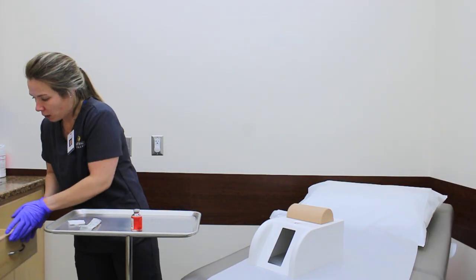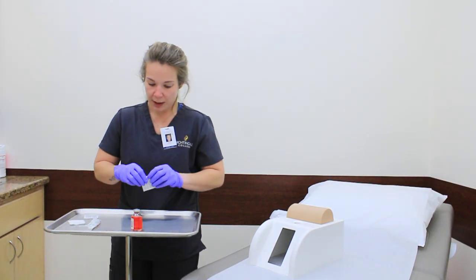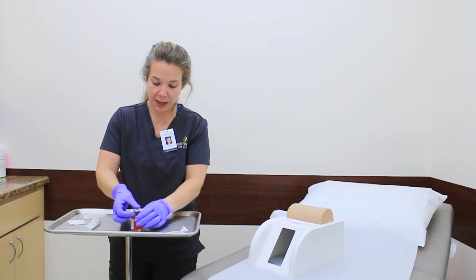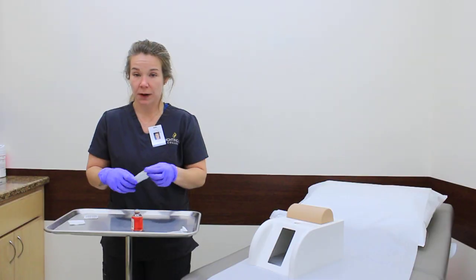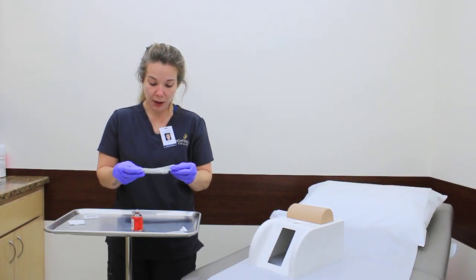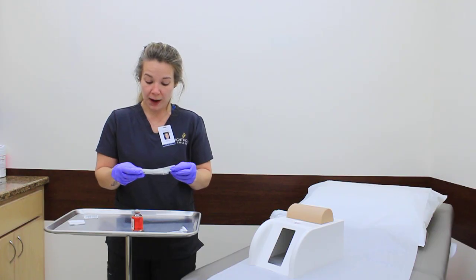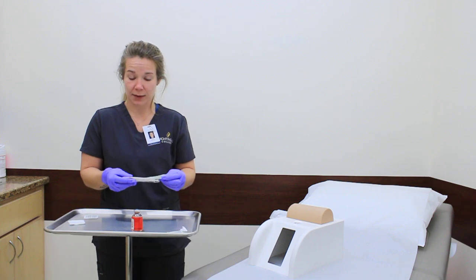I need to grab some alcohol. And you're going to first go ahead and cleanse the top of the medication. And while that is drying, I'm going to verify the correct needle. So I have a tuberculosis syringe here, 1 milliliter, 25 gauge, with a 5/8 needle size. And that is appropriate for an intradermal test.